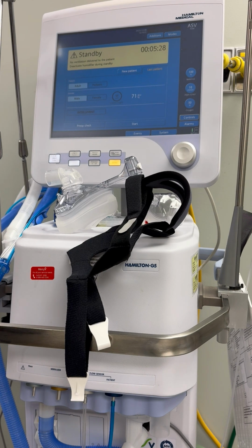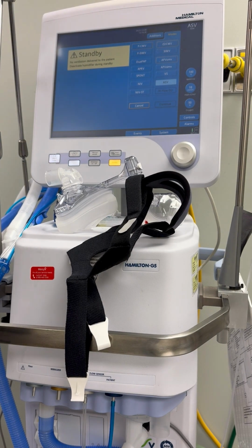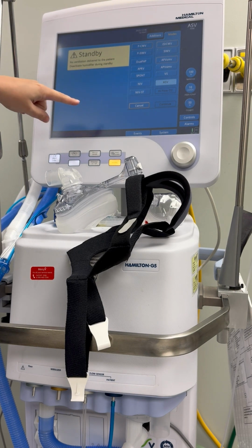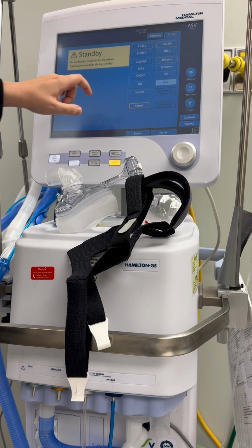So, Hamilton vents, they will default to ASV mode. So, let's go into modes and look at our non-invasive modes. So the Hamilton has two non-invasive modes that are configured for this ventilator. So we have NIV, which is non-invasive ventilation, and we have NIV ST, which is non-invasive ventilation spontaneous time. So these are the two modes that you are going to utilize for non-invasive ventilation for your patient. So let's look at NIV.